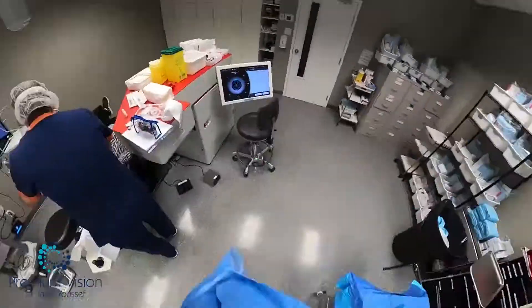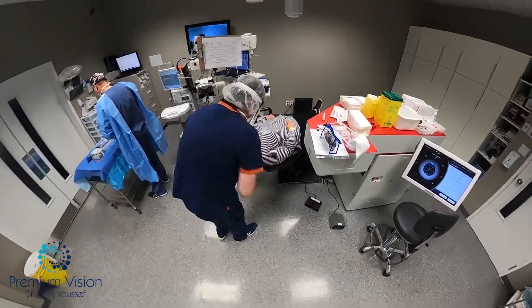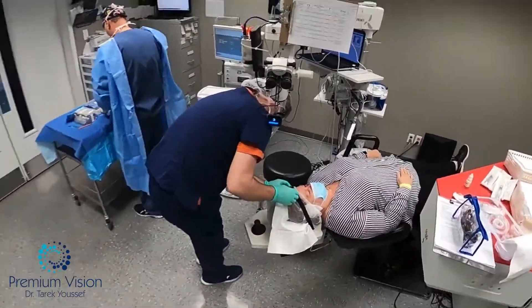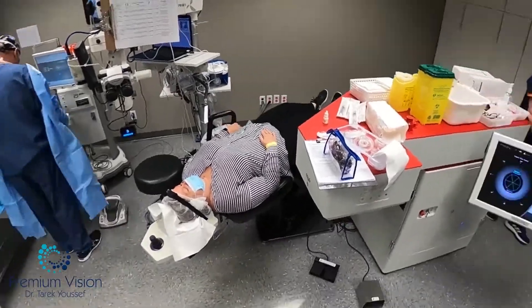Hi, I'm Dr. Youssef, presenting to you this last bilateral simultaneous femtocataract surgery for Fuchs dystrophy with Eyhance lens implants, blended vision.